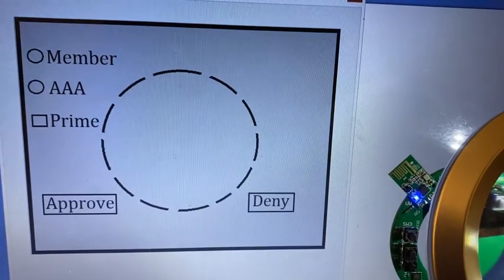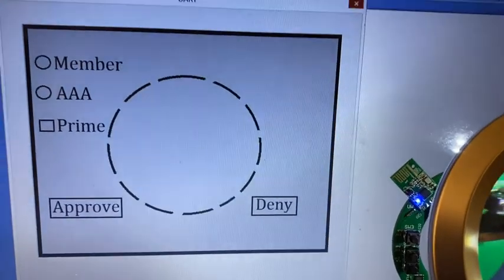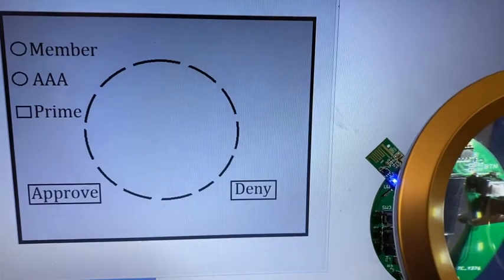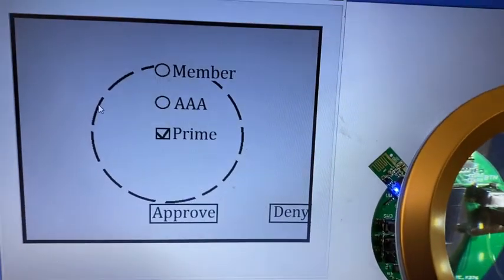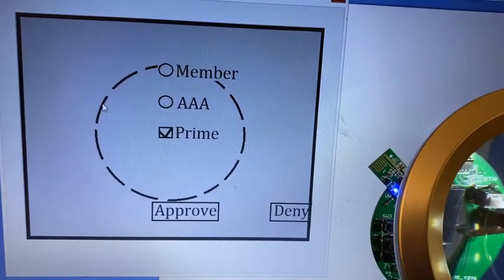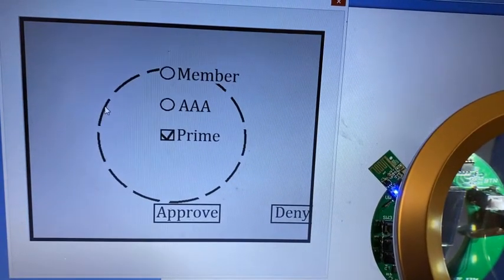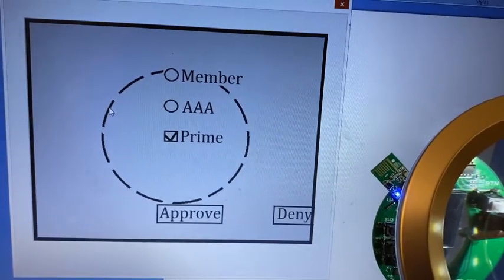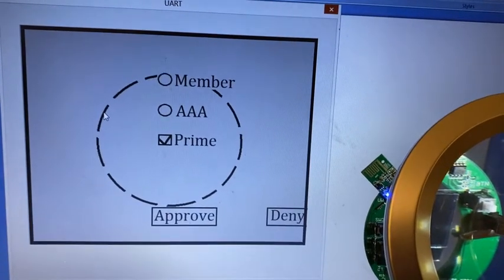Once the system detects an attempt to refocus and accommodate to checkbox prime, the system will shift the position of the image on display such that the checkbox prime comes in focus at the middle of the display. And again, the circular dashed line denotes the portion of display that comes in focus on the retina of our eye. Everything within that section of the display will be visible to the user in focus.